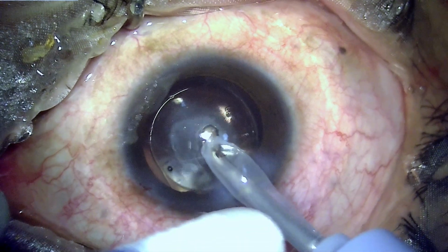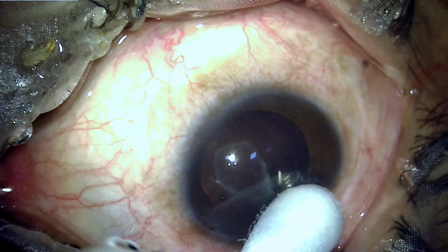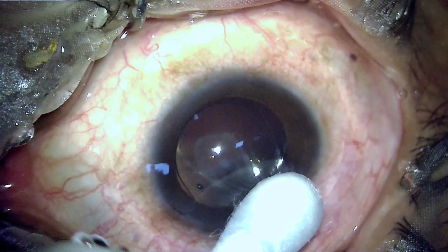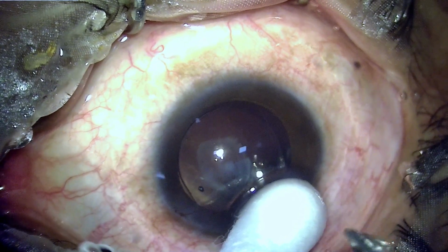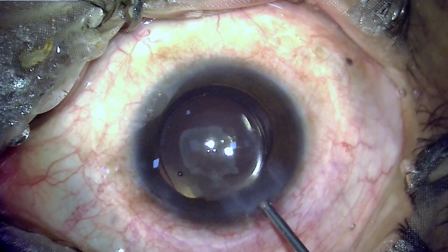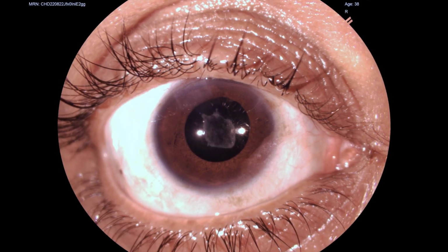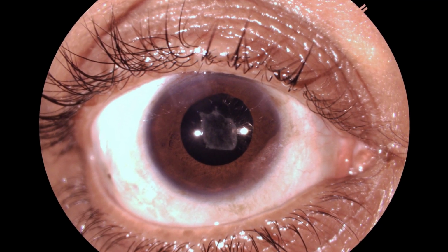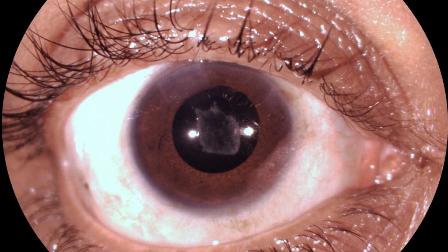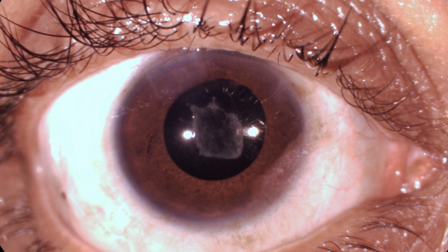Once the irrigation aspiration has been done, you again seal the anterior chamber so as to avoid collapse, and then you fill up the anterior chamber with BSS and seal the chamber properly so that there is no shallowing of the anterior chamber. The surgery has been done, and now this is the post-op day 1 photograph of the same patient, and we can appreciate, apart from the rest of the findings, that the surgery has ended well.